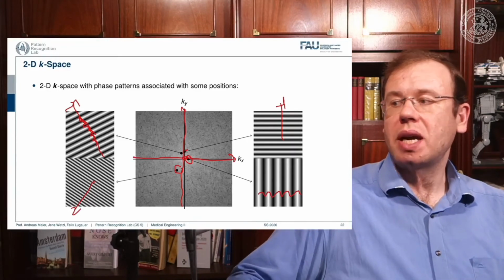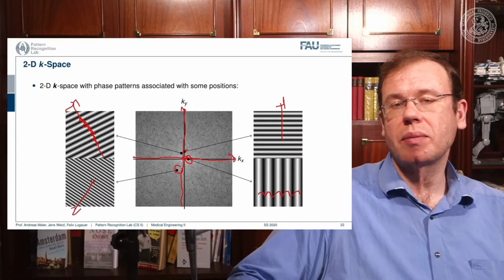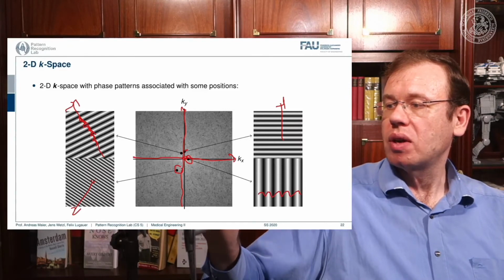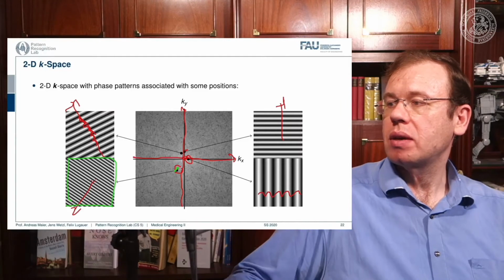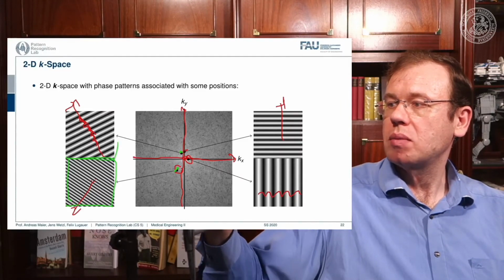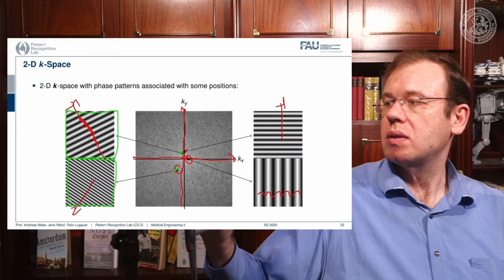Now what I actually measure is this kind of signal pointwise multiplied with the image that I want to measure, and then I sum up over the entire field here and write this value here. And if I want to measure this point here, I take my input image, multiply it with this image, sum everything up and write it into this value.